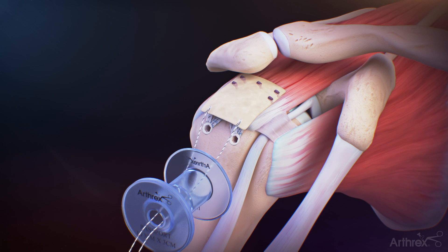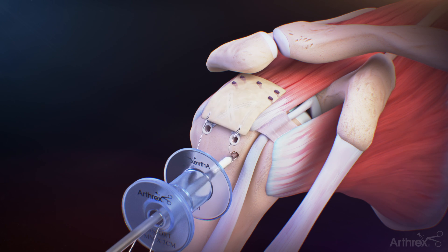For lateral fixation of the ArthroFlex graft, create a bone socket using the punch for the 3.5 mm pushlock anchor. Load the suture tail from the suture tape TigerLink into the eyelet of the 3.5 mm pushlock anchor. Introduce the pushlock anchor into the prepared bone socket and apply desired tension, taking care not to over-tension the graft construct.